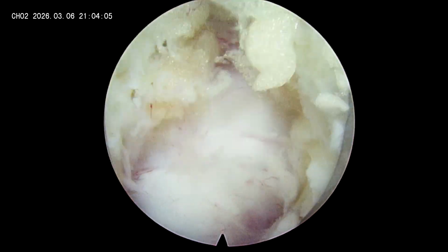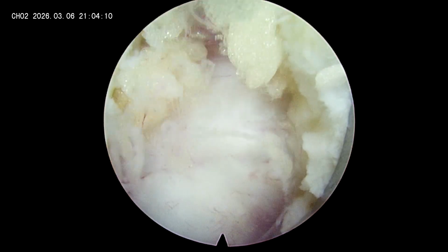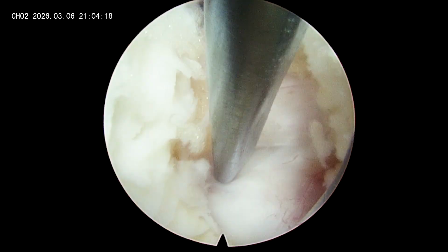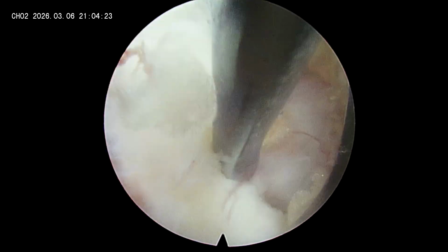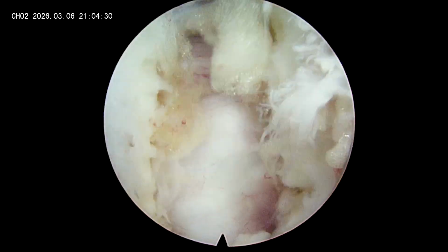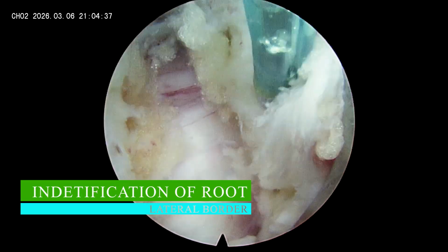The root is a little bit adherent to the underlying disc fragment here. I'll just show you the lateral border of the traversing nerve. That is the lateral border of the root. I'm just separating it. Again, don't be in a hurry. Try to separate the neurological structures and the disc fragment. That is nothing but the traversing nerve root, which has been mobilized because of the disc fragment underneath.